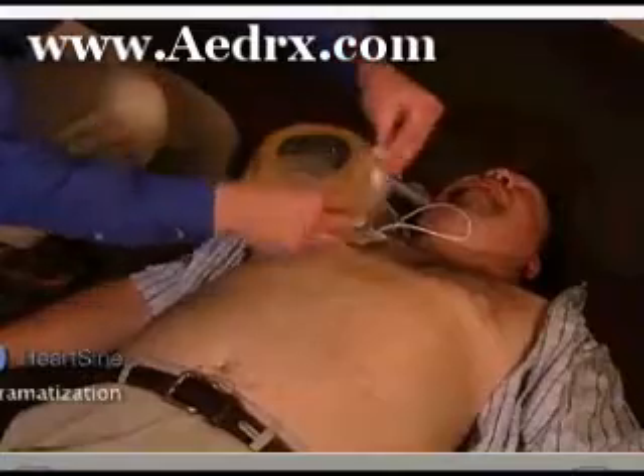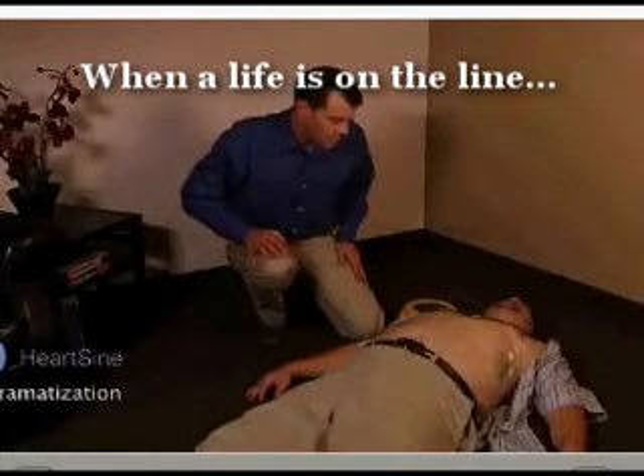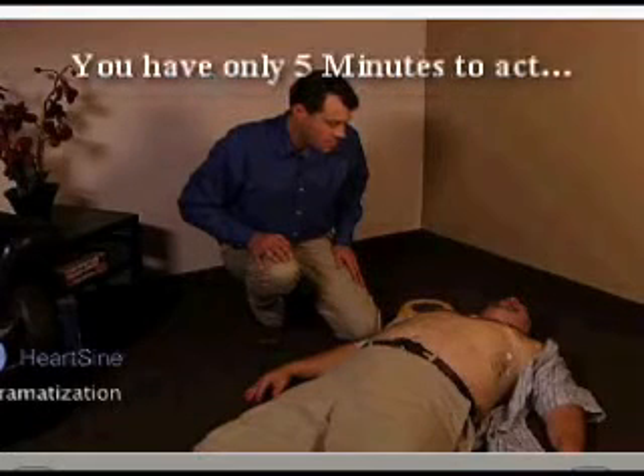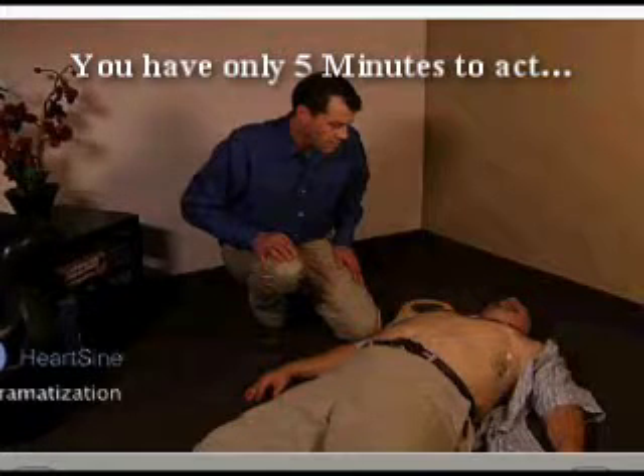Press pads firmly to patient. Assessing heart rhythm. Do not touch the patient. Analyzing. Do not touch the patient. No shock advised.